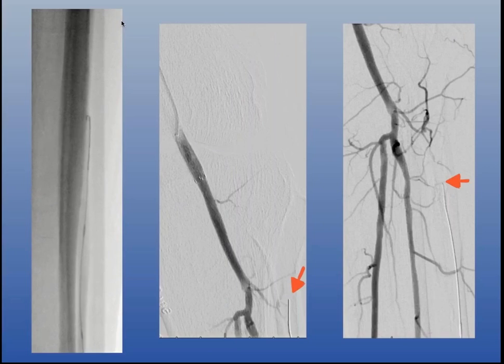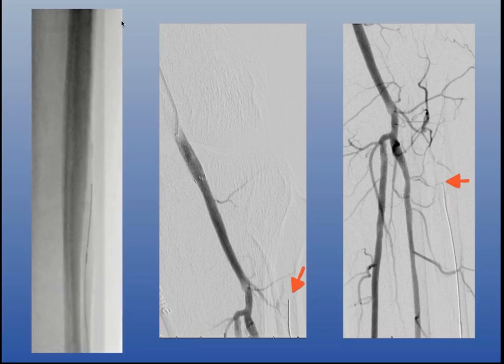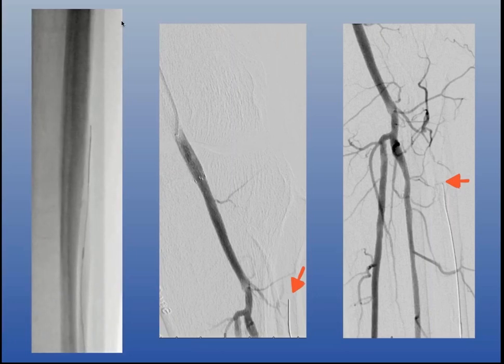I have a catheter and a low tip load guide wire, and you can see I'm using a knuckle wire technique where I'm pushing and rotating and twisting and doing my recanalization. But you can see on the middle image that once again, I recanalized, but now I'm nowhere near where that proximal cap is. I'm clearly in a different subintimal plane.